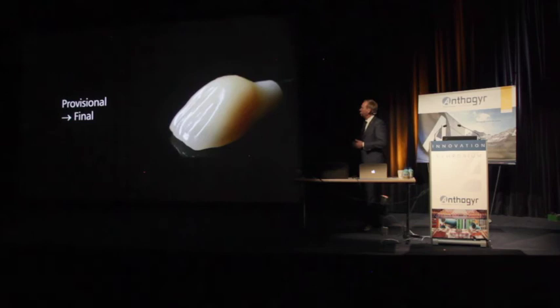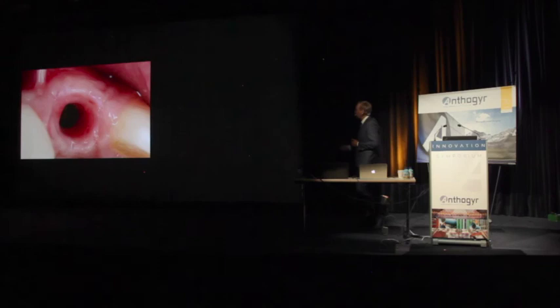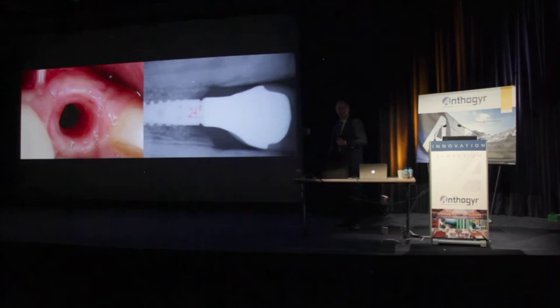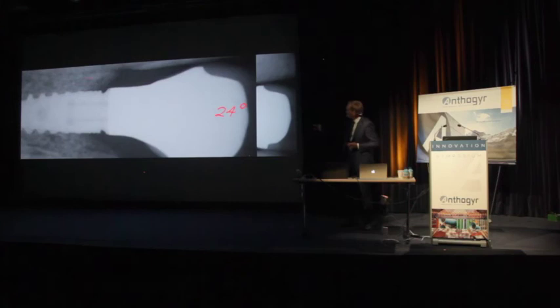I finished the case, and it's same side, same tooth, two implants, still a success. I worked hard for a lot of soft tissue, as you can see, but look at the bone. This is a 24 angle. It goes wide very fast. There is not a big platform shift, and over time, this will create crestal bone remodeling and some bone resorption, and I'm not happy with that. So this is not helping me to keep my bone level stable.